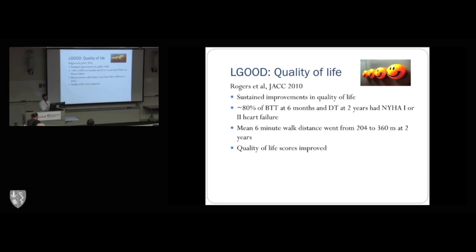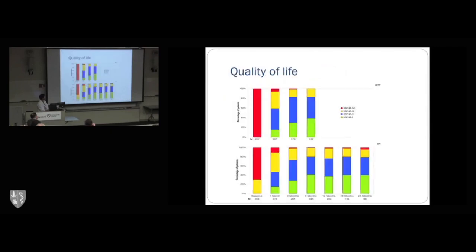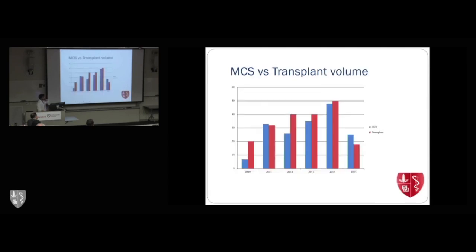These patients do, however, have improvements in quality of life. So Joe Rogers, who's at Duke, looked at quality of life in both bridge to transplant and destination therapy patients. He found that the 6-minute walk distance improved, and so did quality of life scores. And this is what you see, that at baseline, patients were NYHA class 4, so essentially almost bedbound, and they improved over time. That improvement was also sustained. So because of that, I think we've had more acceptance in our community and worldwide for LVAD therapy.